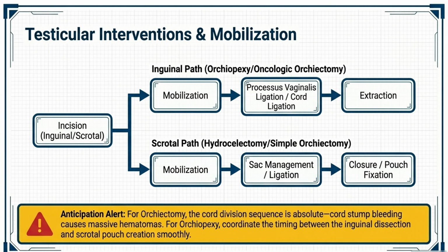This slide reinforces the importance of anticipating surgical steps. Recognizing patterns allows the technologist to prepare instruments ahead of time. Efficient workflow reduces delays and improves patient outcomes. Consistency and organization are key.